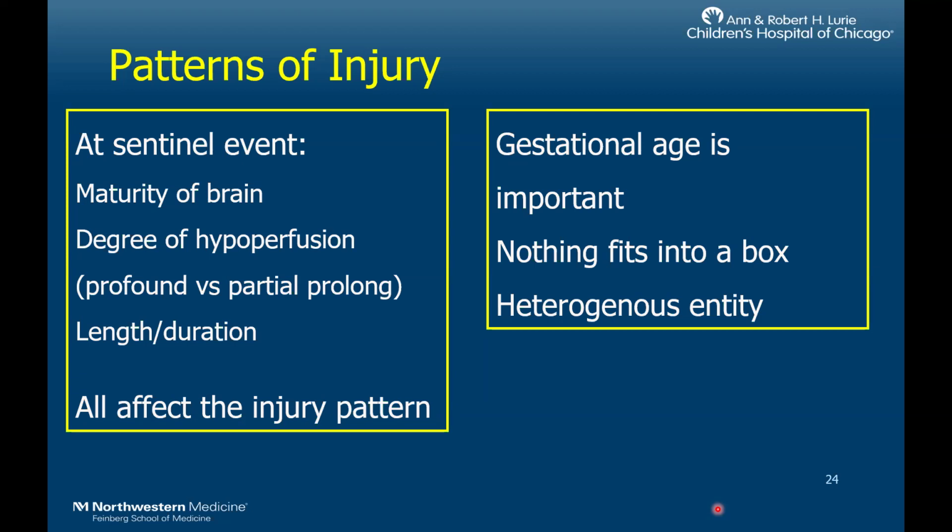And I would say, even though we have defined these injury patterns into nice, well-defined boxes, things don't fit quite well in these boxes. So these are kind of just recommendations, and nothing always quite fits the textbooks. And this is a heterogeneous entity.